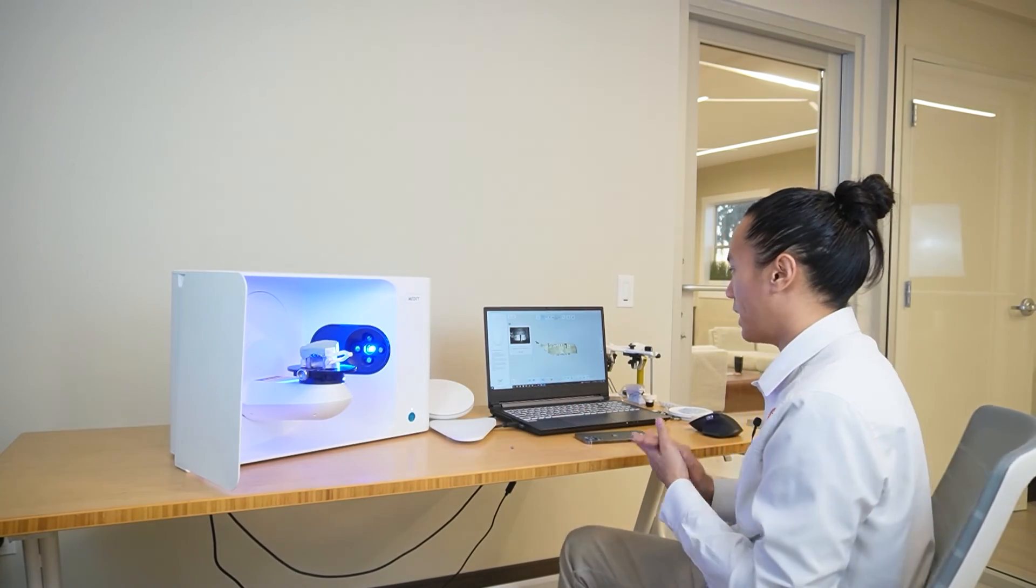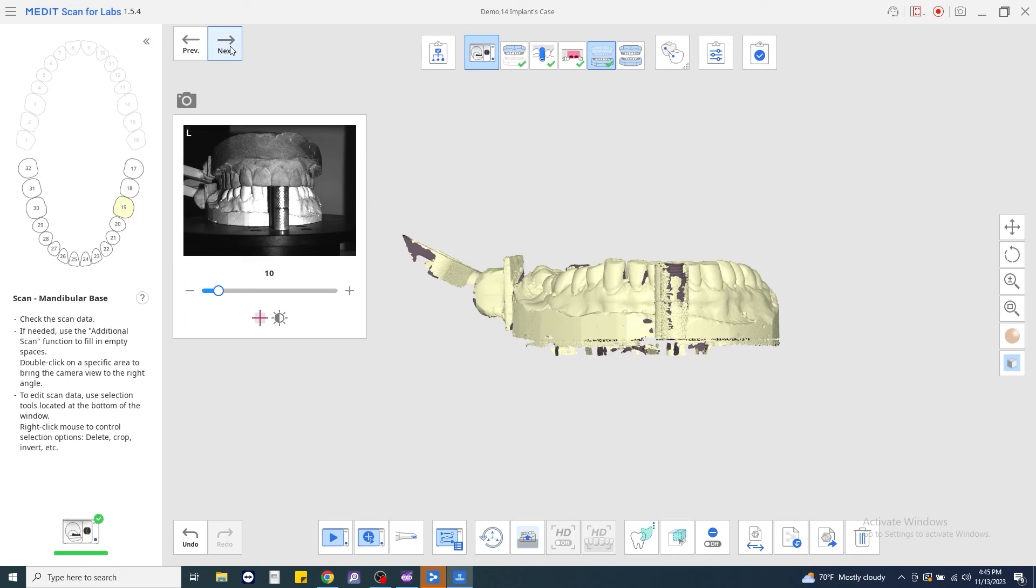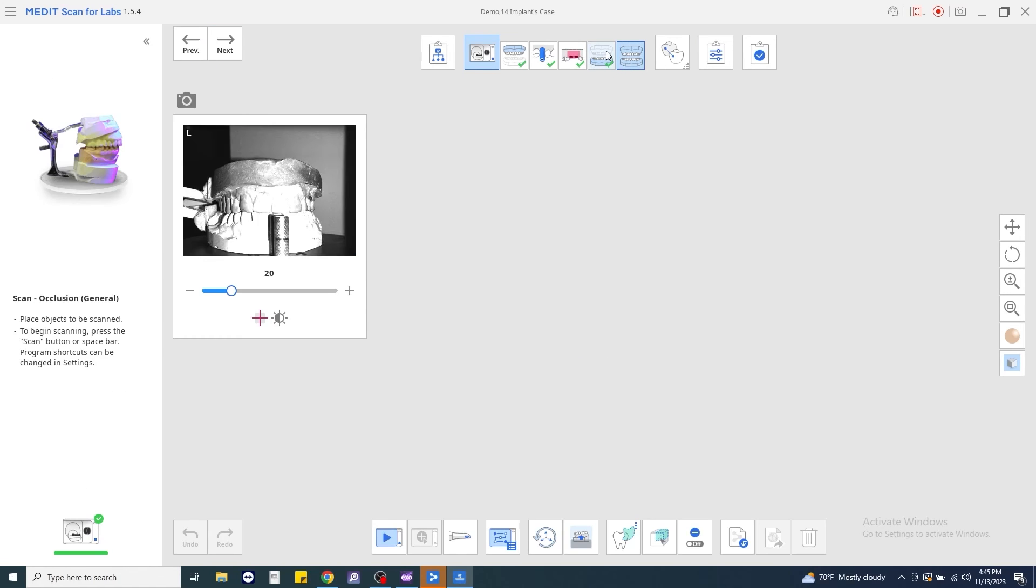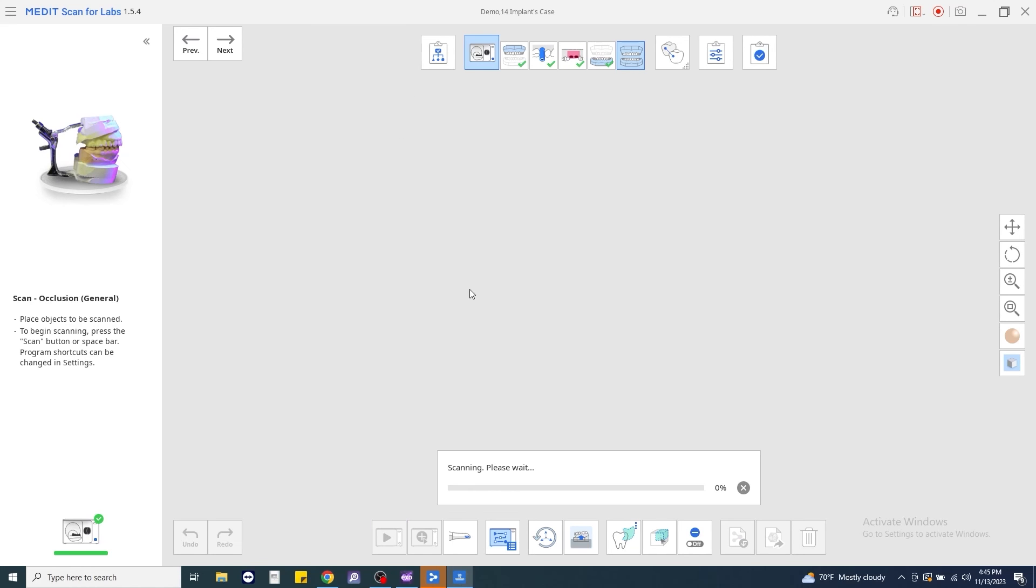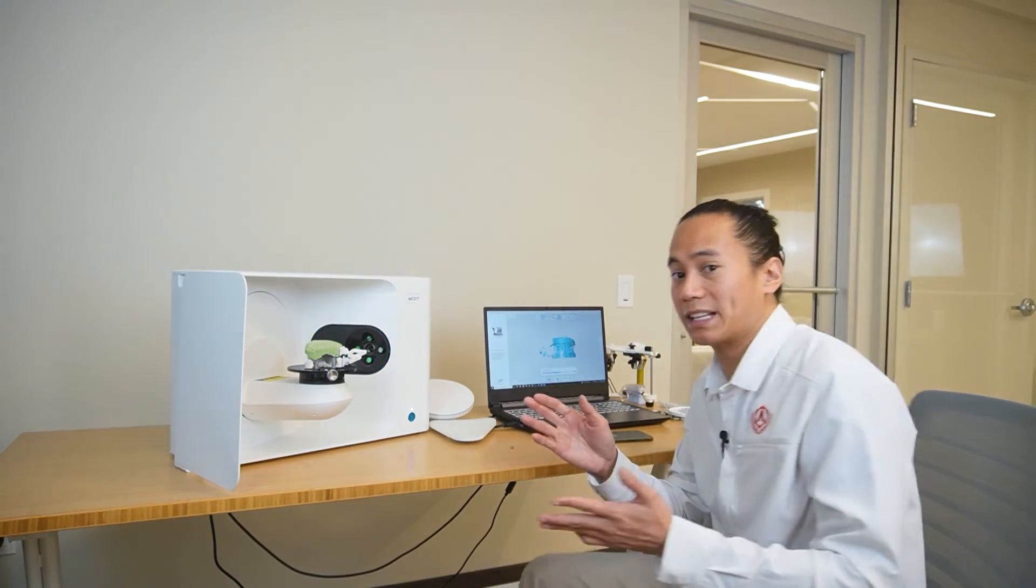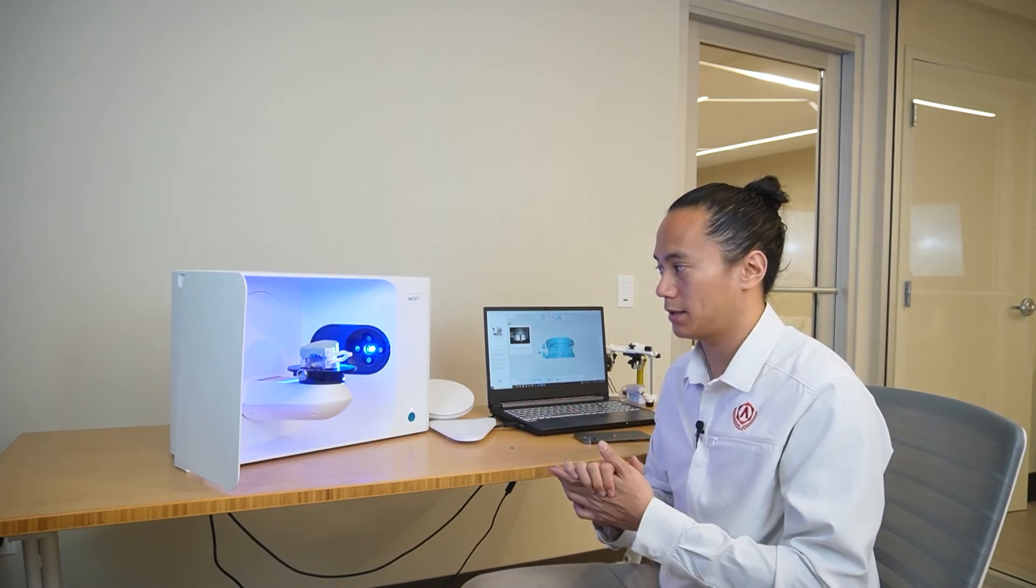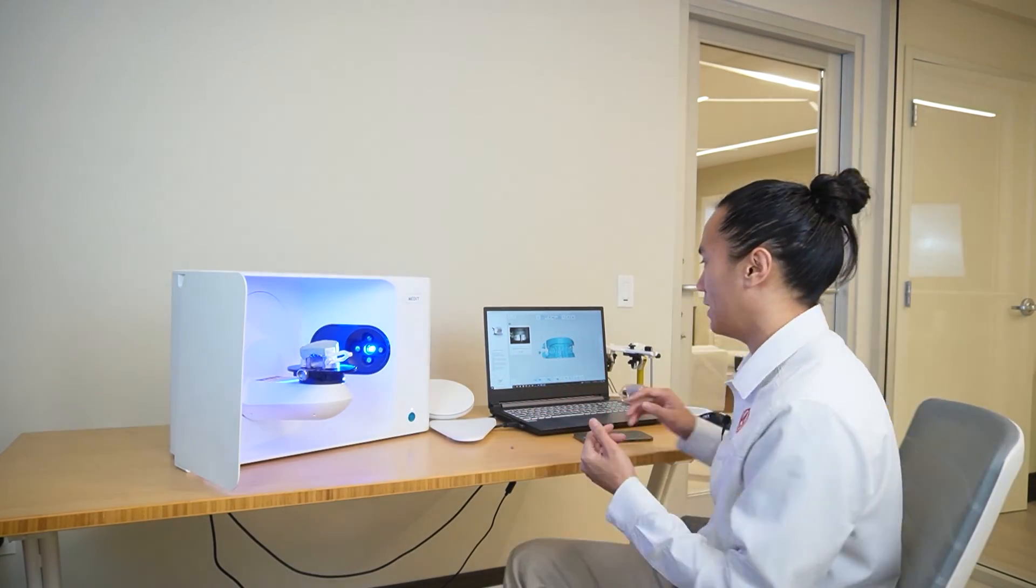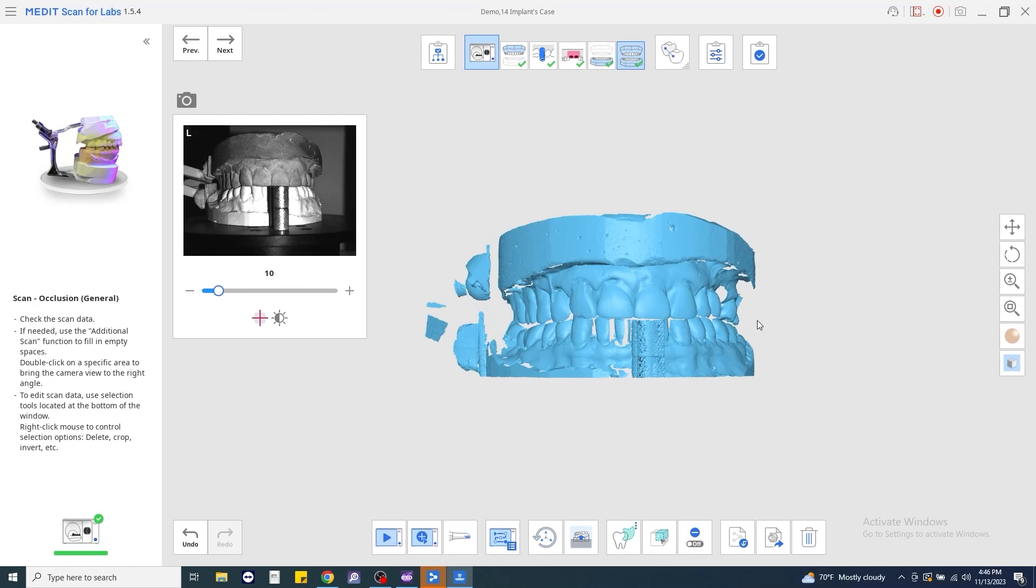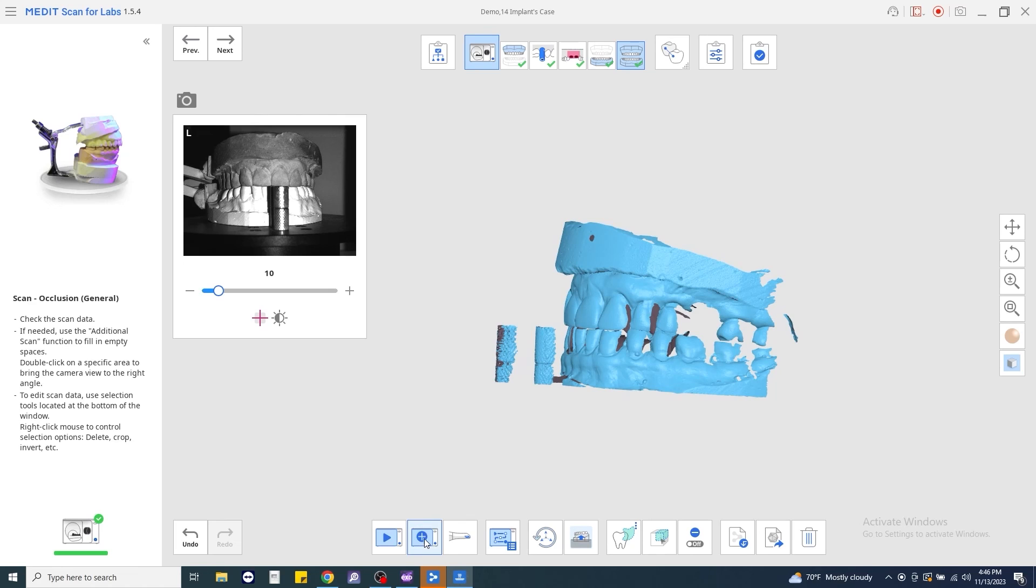As always, double check your brightness. Click Scan. We're going to actually make sure that we have it on the bite alignment step. Now, the software should automatically grab the bite data from all sides of your models. But if you need to add an additional scan, you can always rotate the image on your computer here and then click Additional Scan on the screen.